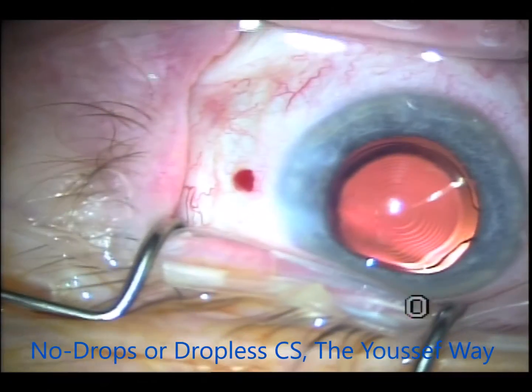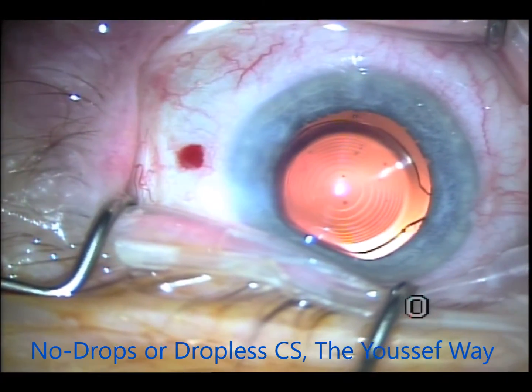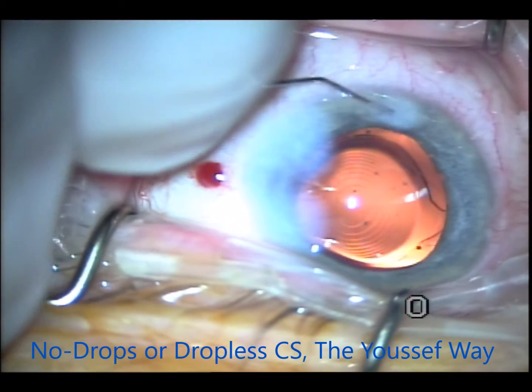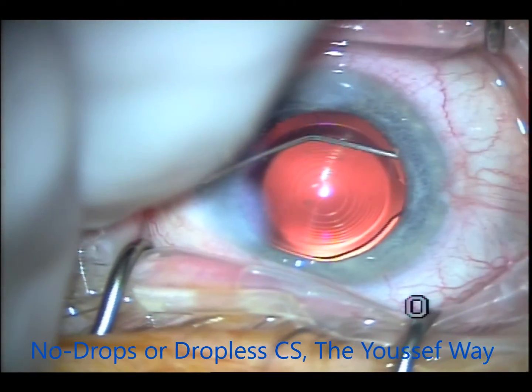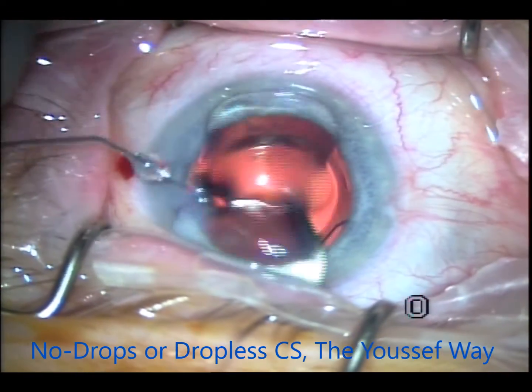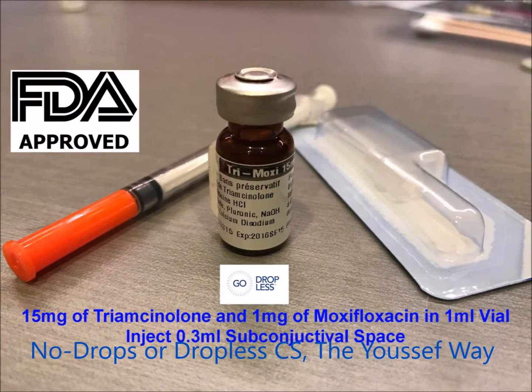This is the first patient — this was a Symphony implant. I'll show the relevant part. First the BSS, then the moxifloxacin at 150 micrograms per 0.1 ml. I hydrate both wounds and inject into the anterior chamber, into the sulcus, and into the bag, so every space intraocularly is replaced with moxifloxacin at 150 micrograms, which is above the MIC. I then apply the remainder on the surface. This is the FDA-approved Tri-Moxie from Imprimis.